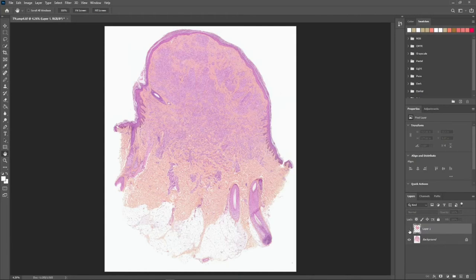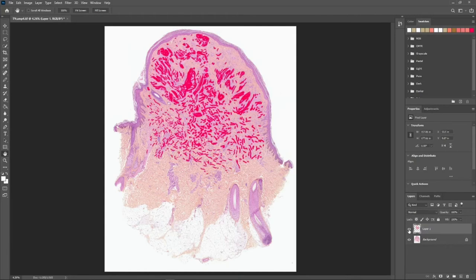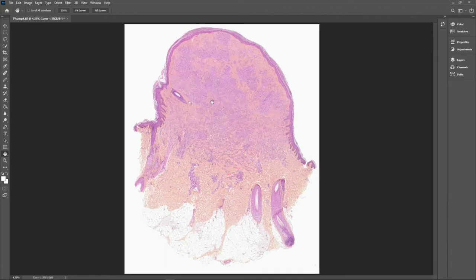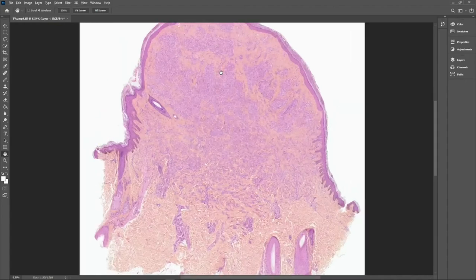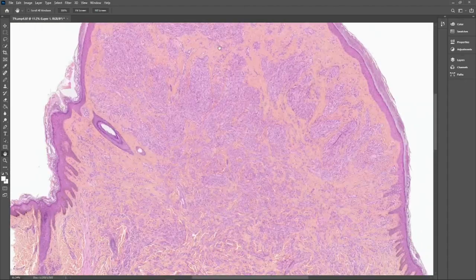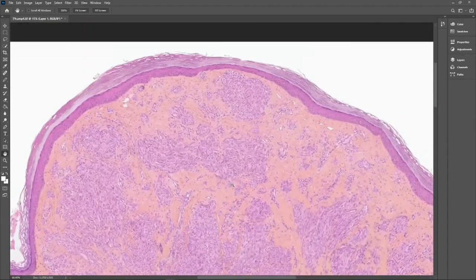To show you the plexiform architecture, I have painted all the cells in red and you can visualize the expansion into the deep dermis. Now moving to high power, let's look at the cytology.